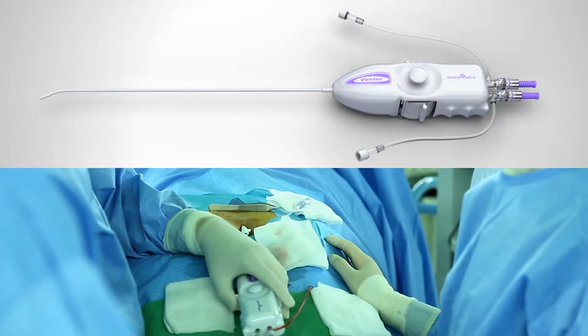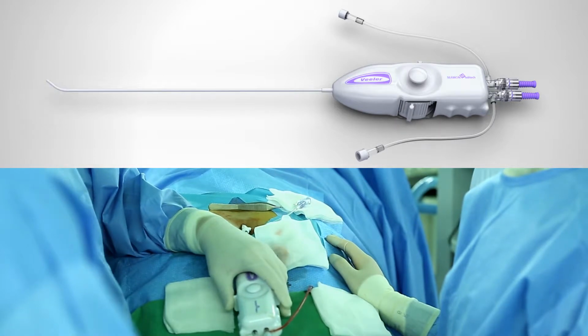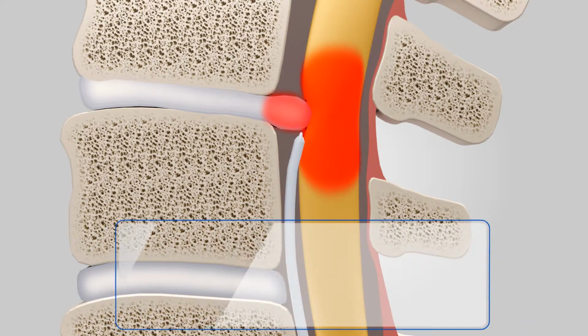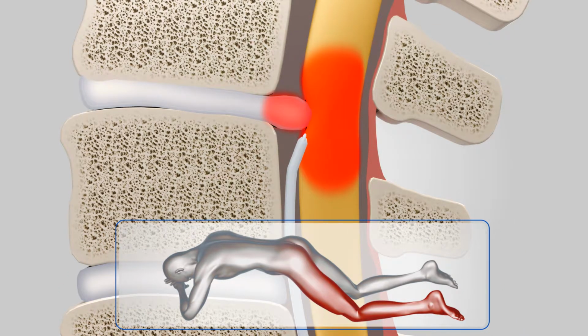After you reach the targeting point, you need to double confirm the disc area by steering the catheter to the left and right. If the patient complains of severe pain after slightly pushing the laser fiber to the supposed target point before stimulation, there is the possibility the laser fiber has touched a nerve. In other words, to use lasers safer, the surgeon should find out where the pain point is by stimulating with laser fiber or endoscope cable.